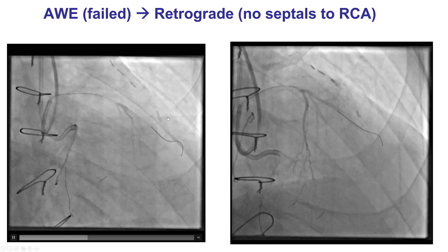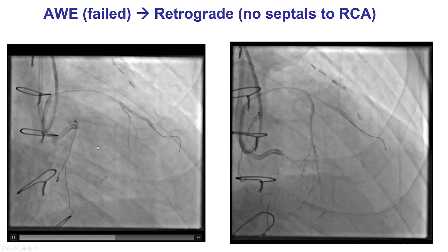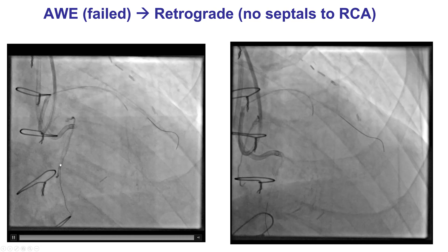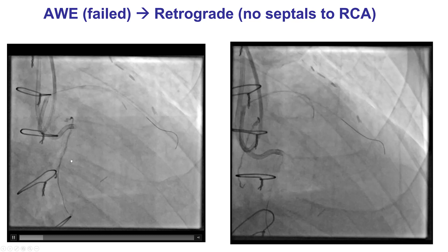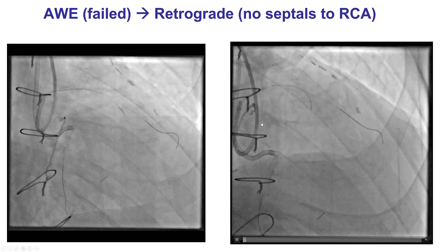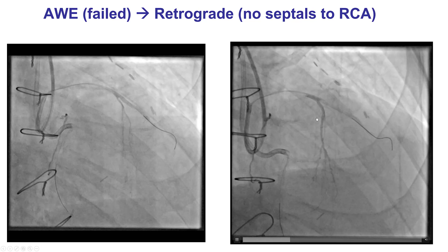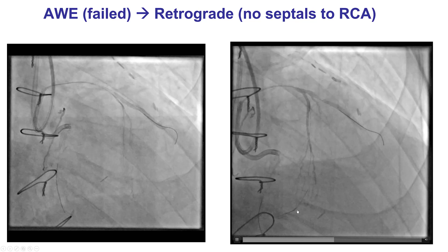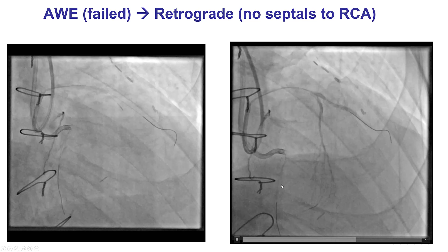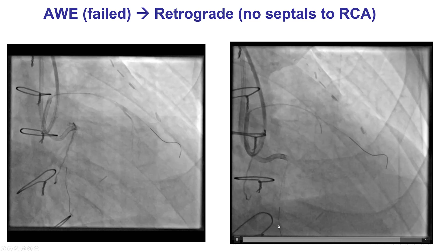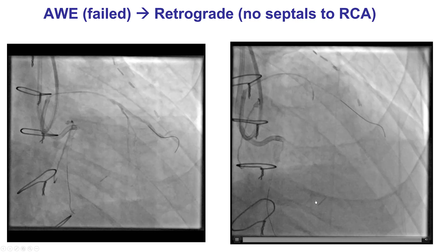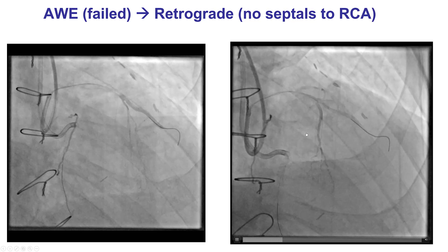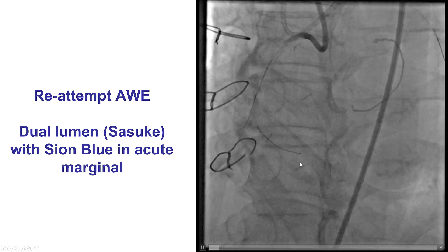We tried antegrade wire escalation, but we were unable to engage the occlusion, and we decided to switch to retrograde, as we thought that there was a good connection with the PDA, although there was no opacification of the PDA from the septal on this selective injection.